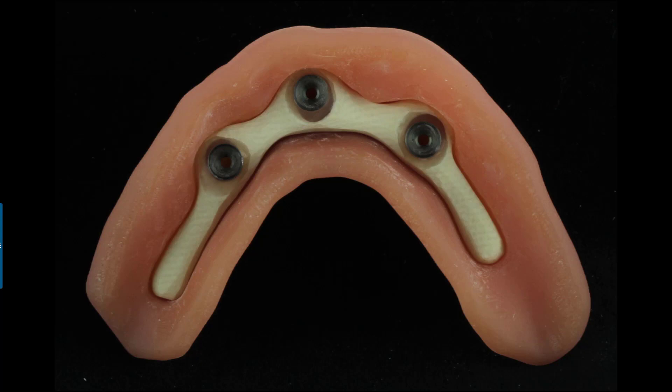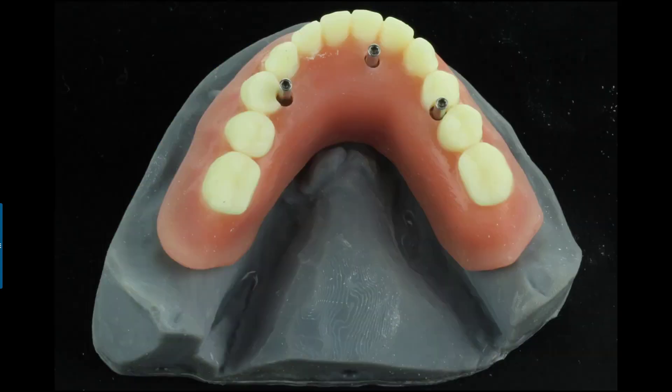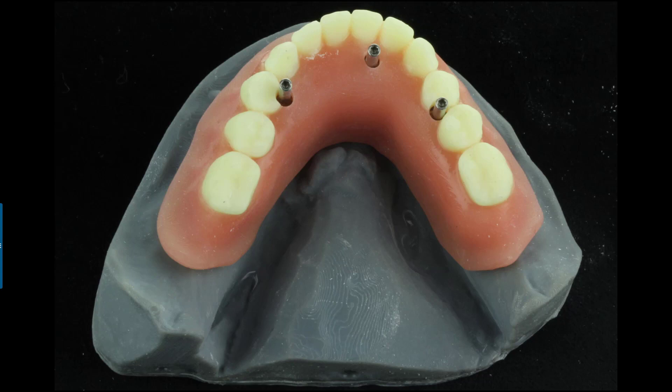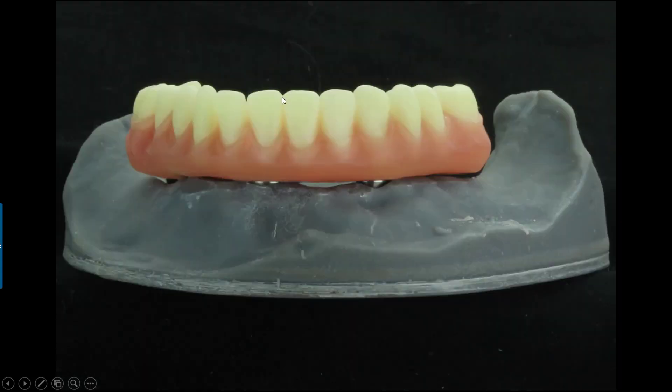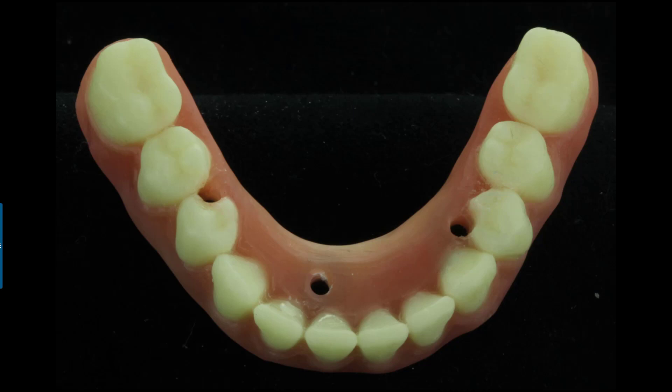If you don't mind doing a next day or a much later that day restoration, you could actually just scan this bar now that it's in their mouth and design a denture in the Blue Sky Bio full denture software. That's what I actually did here. That's how I got the very precise slot created for this. The denture was made to just sit right over the top of this with a little bit of a spacer. Now I can make some extremely small holes for long screws to fit through this, do a pickup, and then you can simply cut flanges off, salt and pepper the underside, make it cleansable and ovate, and you end up with a very strong temporary that's aesthetic, that's low in profile, and that's indestructible.